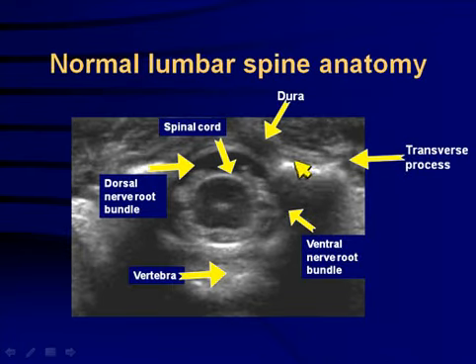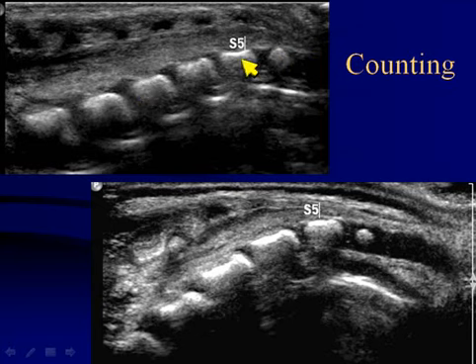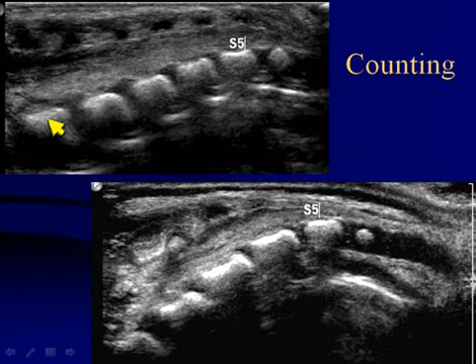Here again we have the transverse process, the cord, the central canal, and the nerve roots. When counting, we start from below. The coccyx tends to be a more circular structure than the sacral elements. Once the coccyx is identified, we can start from S5, 4, 3, 2, 1, and count upward. Generally, the L5-S1 level has a mild transition where the bowing or bending change is seen.